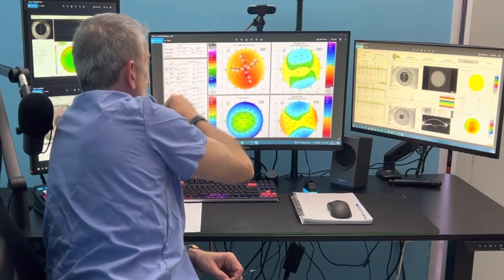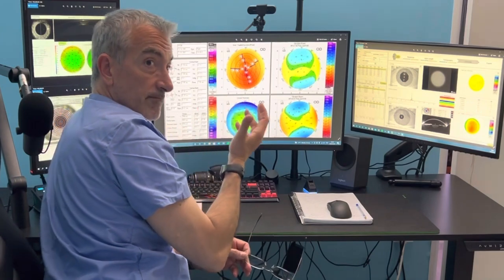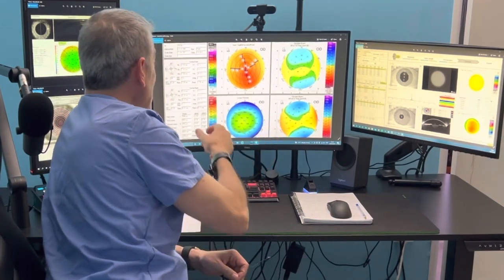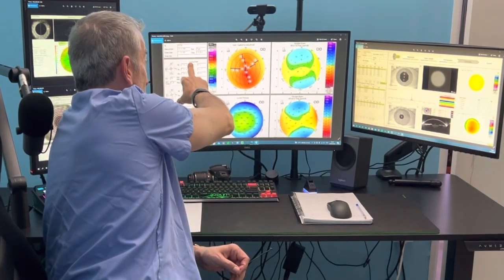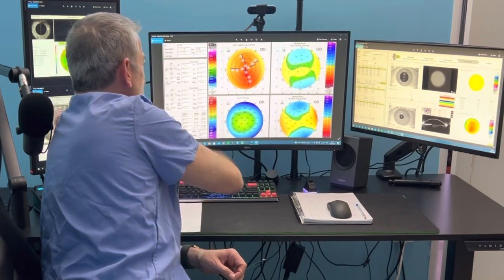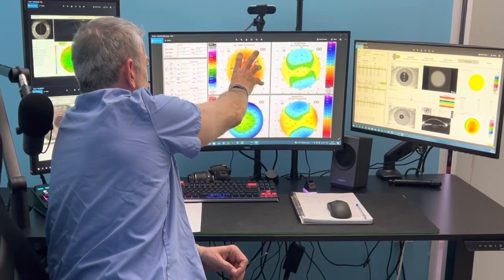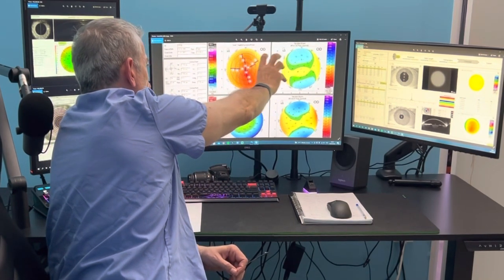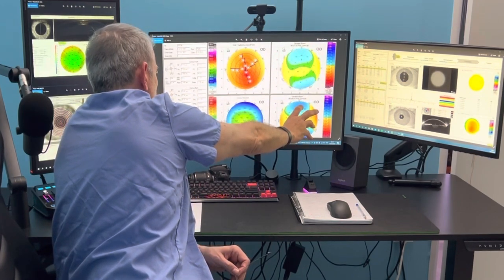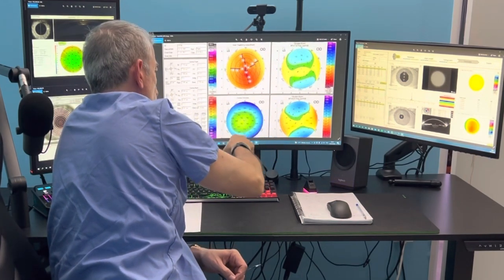Unfortunately, Oculus has not changed this yet — it's been almost 20 years — and it reports this as anterior cornea data, but these are total cornea data: total cornea power here, anterior elevation here, posterior elevation maps, and the pachymetry maps.